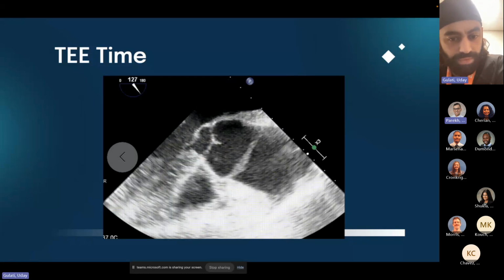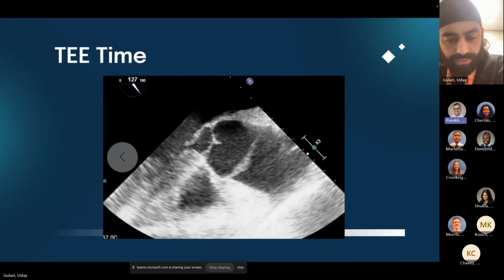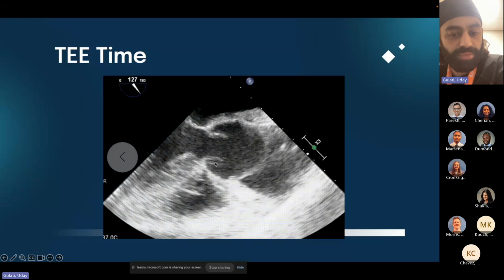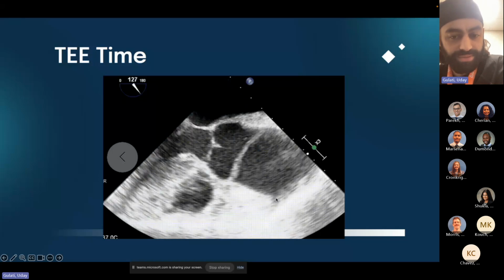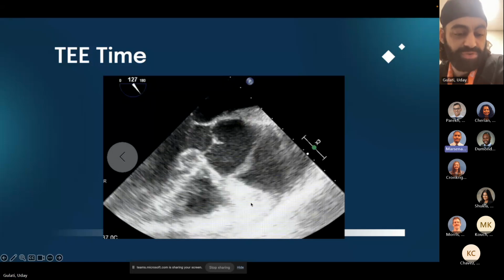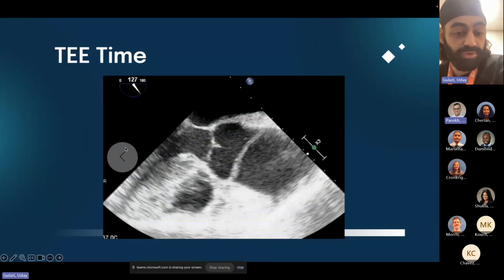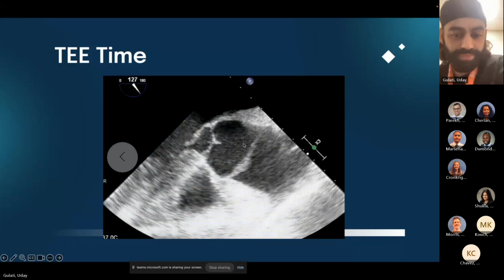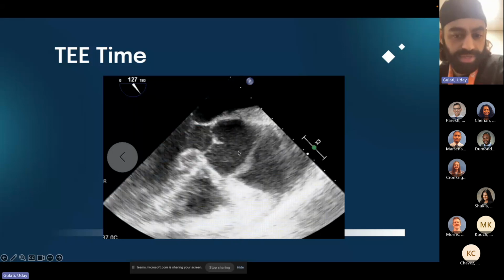Look, doesn't look like there's much opening, so I'm gonna guess aortic stenosis. So if you had aortic stenosis, would your outflow tract be this big? Would you get this big descent? And would it be wide open like this? Dissection. Because if you had aortic stenosis, is that a left ventricle? Is that a dissection flap? Is that what that is? Yep, that's a dissection flap. Right, and TEE is one of the best ways to pick this up.